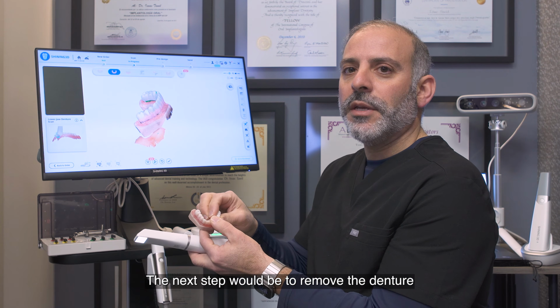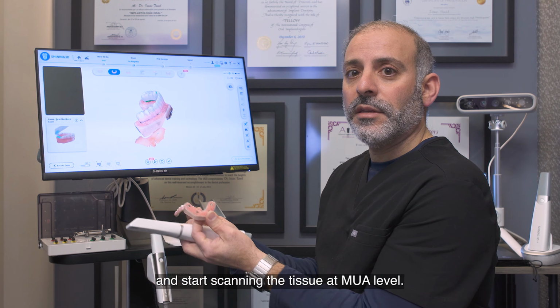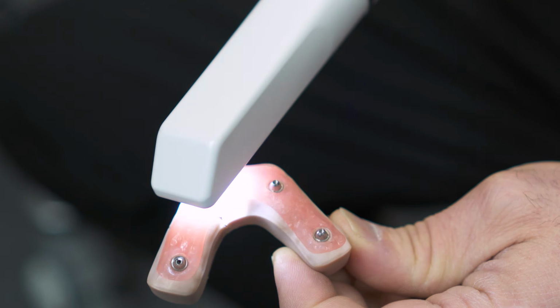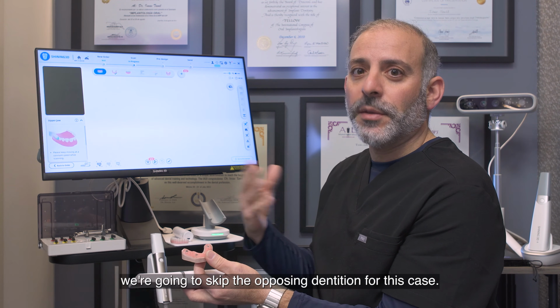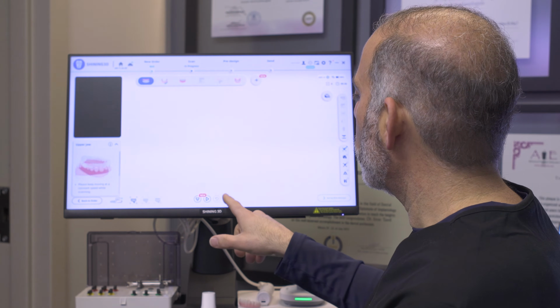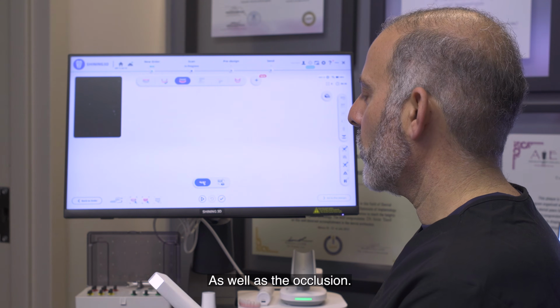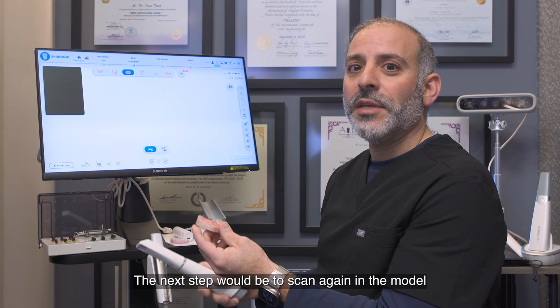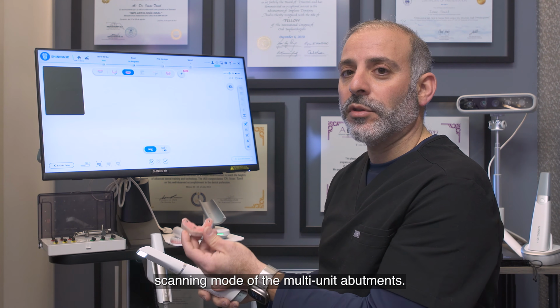The next step would be to remove the denture and start scanning the tissue at the MUA level. Since there is no opposing dentition on this model, we're going to skip the opposing dentition for this case, as well as the occlusion. The next step would be to scan again, in the model scanning mode, the multi-unit abutments.